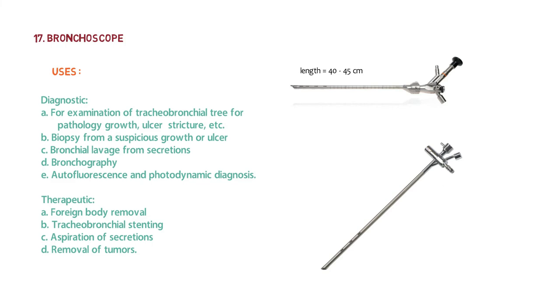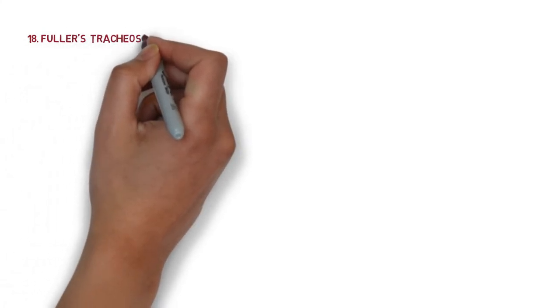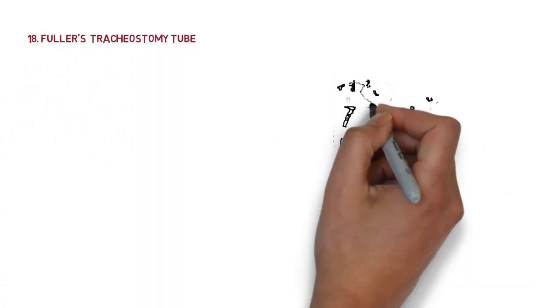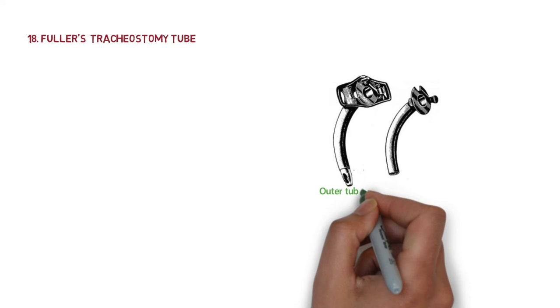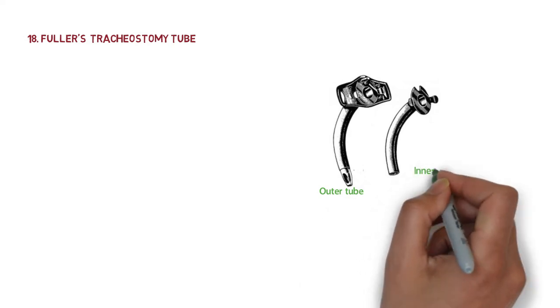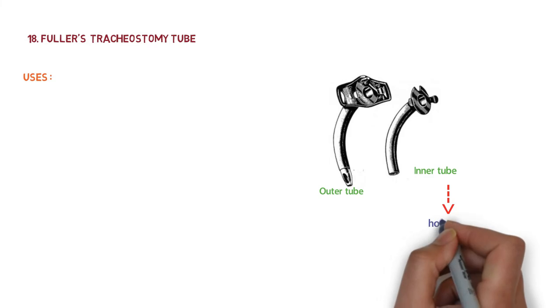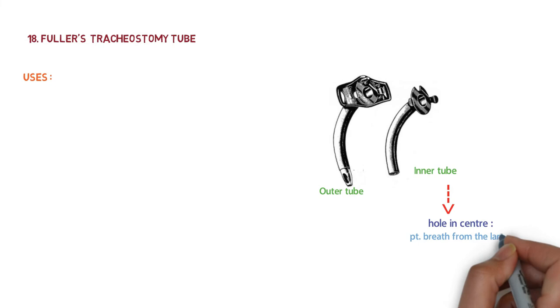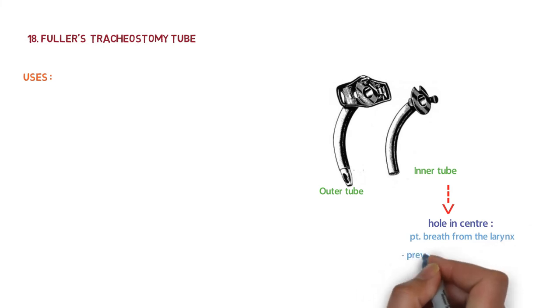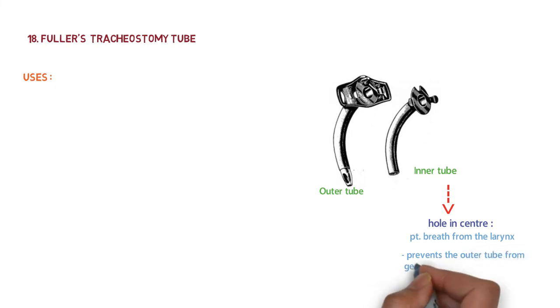The next instrument is Fuller's tracheostomy tube, which consists of an outer tube and an inner tube. The inner tube has a hole in the center so that the patient can still breathe from the larynx even when the tube is blocked at its outer end. It also prevents the outer tube from getting blocked by secretions.